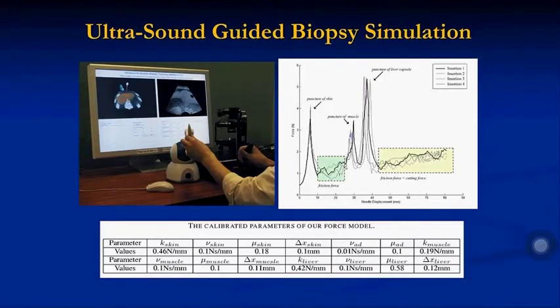So in these figures, in this setup, we can also see that the force during this process is simulated, and we can observe that there are some peaks during this needle insertion process. It is at the puncture of the skin, the puncture of the muscle, as well as the puncture of the liver capsule. So that the user can in fact experience different force feedback sensations during the surgical simulation.